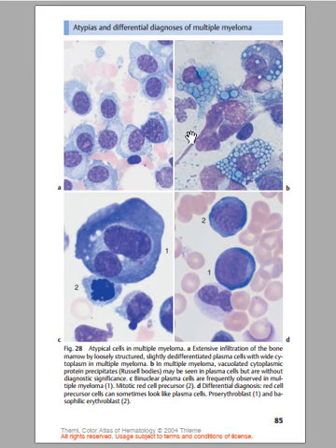Now, B is a multiple myeloma here with vacuolated cytoplasmic protein, so protein precipitate. So you see here, this one, they are differentiated. Normally the plasma cells are not supposed to look like this, but in this case you see the plasma cells have many vacuoles in the cytoplasm like that, and the histochemistry shows that it is actually a plasma cell.